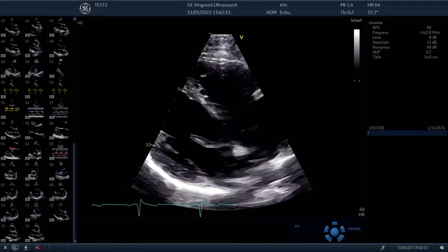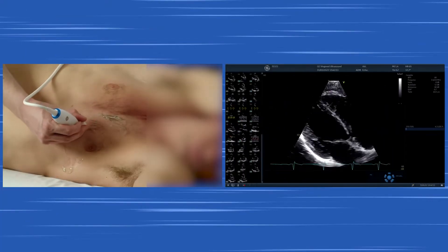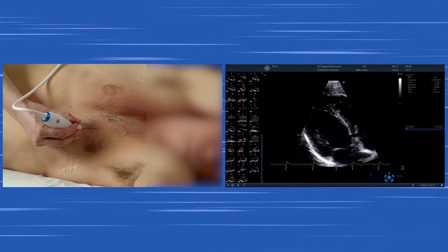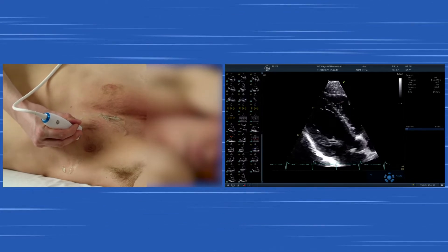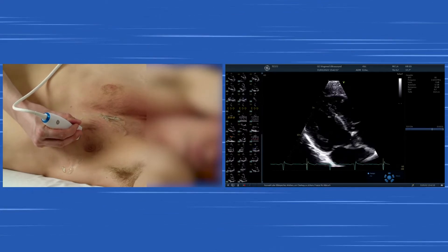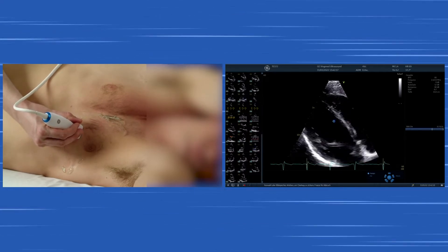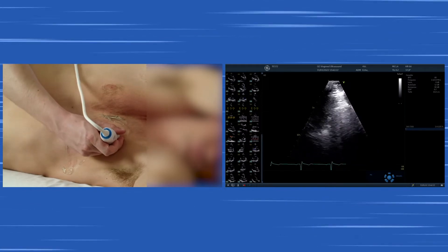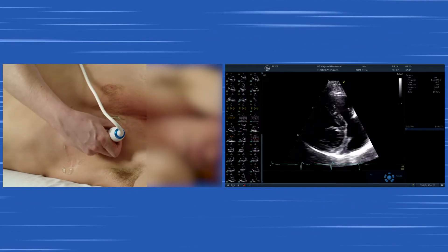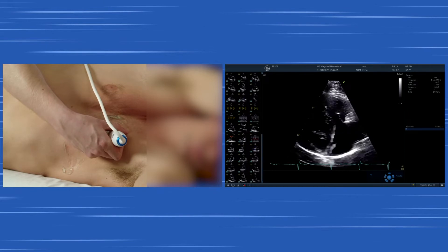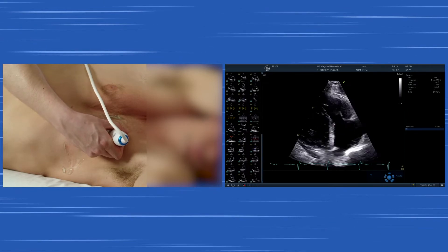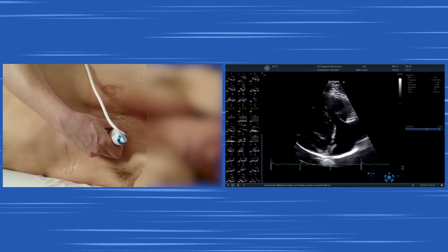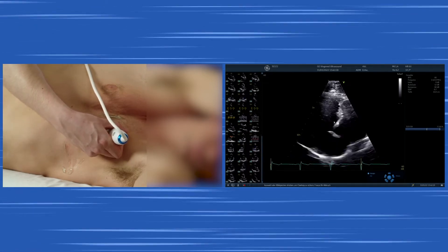To continue in the parasternal long axis we can move intercostal spaces up and down. Depending on what we do we can either see the apex if you move downwards, and if you move upwards and tilt the transducer downwards we can see the right ventricular inflow view with the right atrium and the right ventricle.